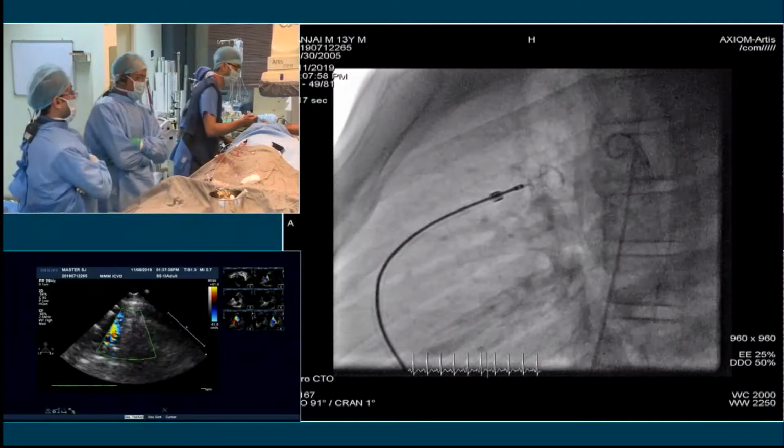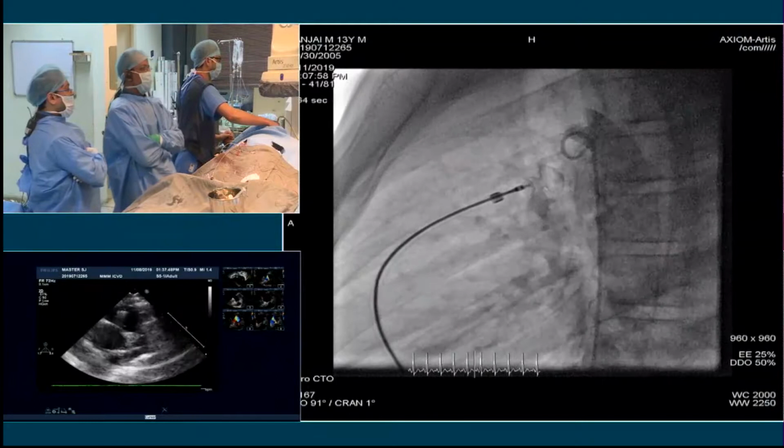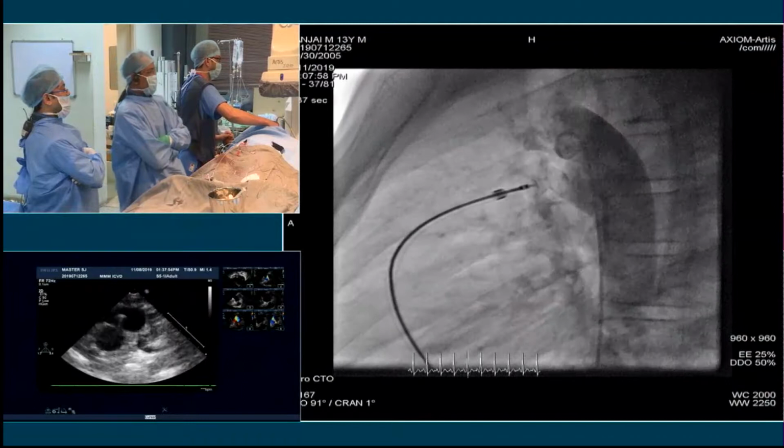I agree, Kannan. There are different groups of people. Some are comfortable with the arterial angio, and there's a group of people who are happy with the venous angio. I always take artery plus venous. That's what I go on, Muthu. Anyway, we are going to release it off.